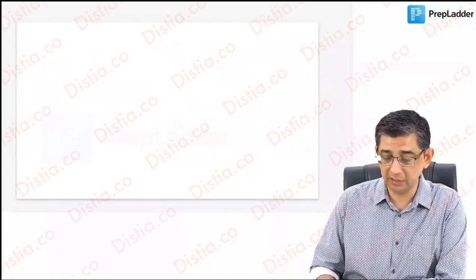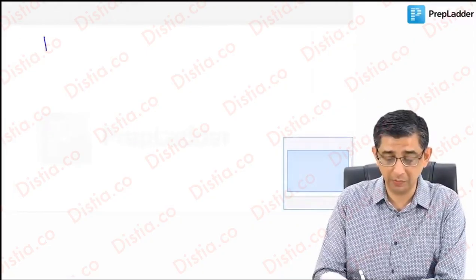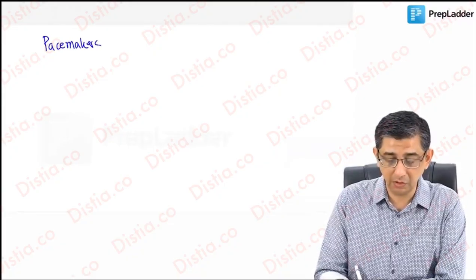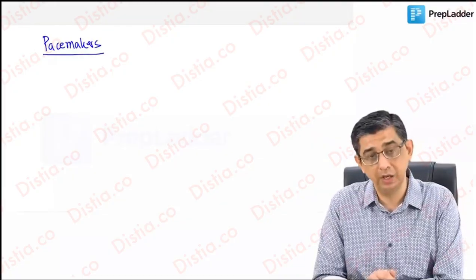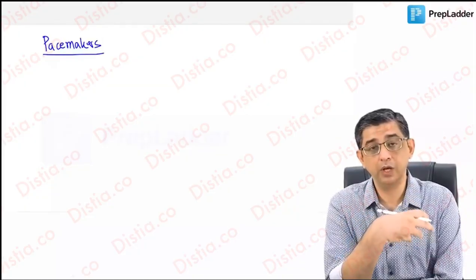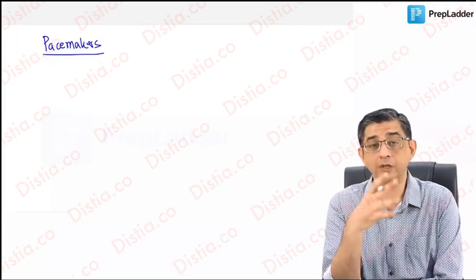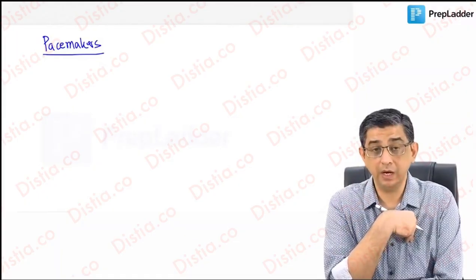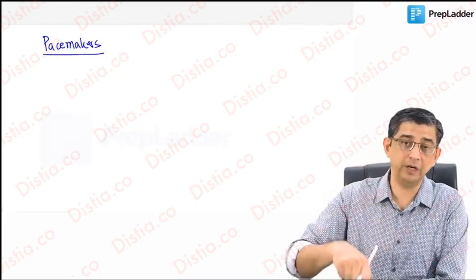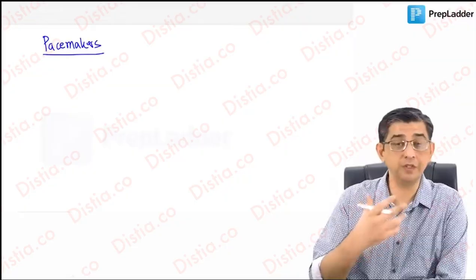Now, moving ahead in our discussion, I will be teaching you regarding where you put in the pacemaker and how this pacemaker circuit will be functioning. In fact, now these pacemakers are not going to be affected by any kind of radiation. I can put it like this: when I was a student at your age, the pacemakers that were put had a peculiar problem that when a person used to go to the airport, he had to actually declare he is having a pacemaker, and therefore these patients were exempted from screening. That metal detector that they use at the airport could actually interfere with the functioning of the pacemaker.